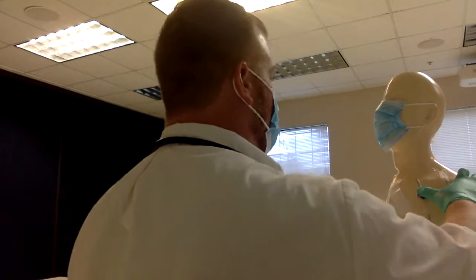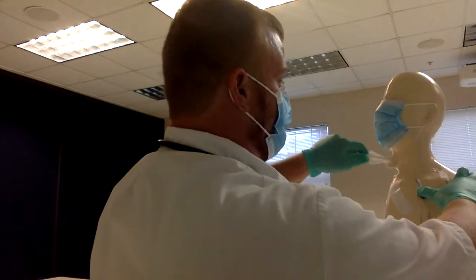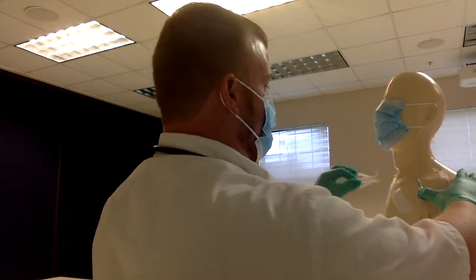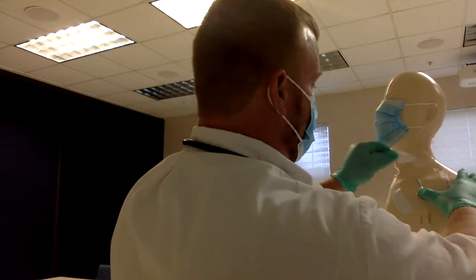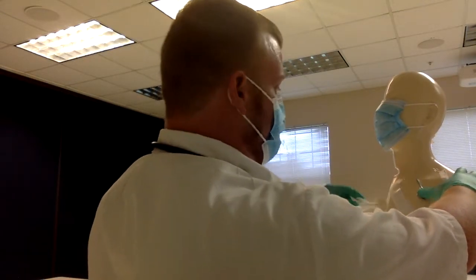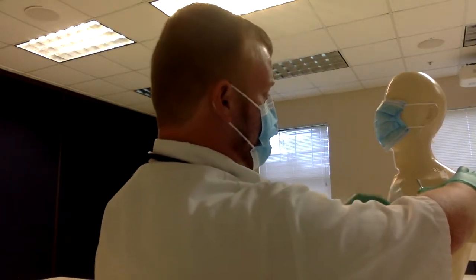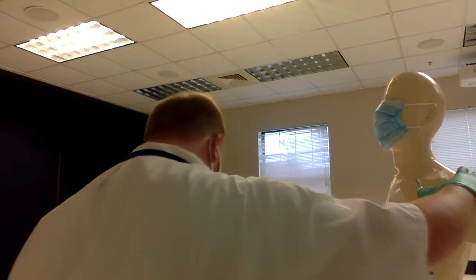Sterile hand, left hand, you're gonna go back in your sterile field and get another one, crack, and now you're gonna work around the area, holding this at all times because you don't want that catheter to come out of its area. You're gonna scrub a little vigorously with this one, it's a little stronger. Some evidence says that with this step you can also clean the leads that are coming down. Not the actual ports down here, but just the lines, to make sure there's nothing on it. So now that is done.